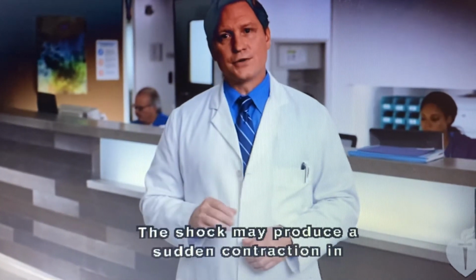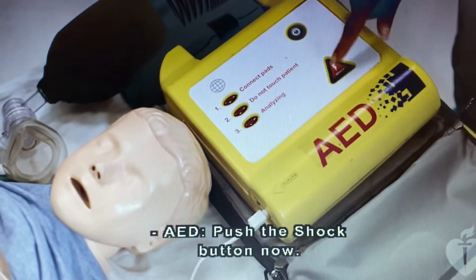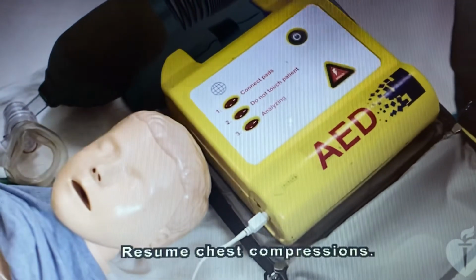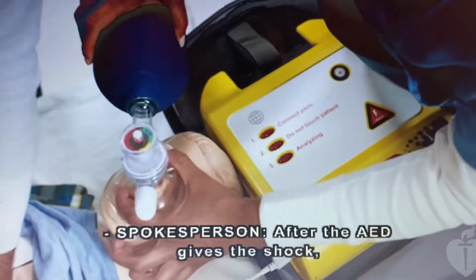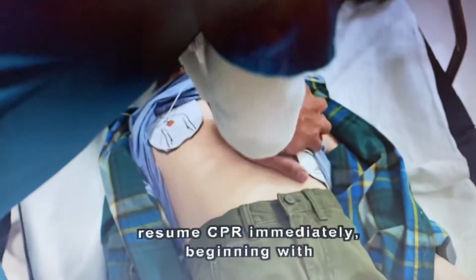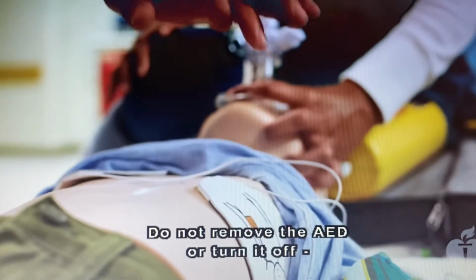The shock may produce a sudden contraction in the victim's muscles. Push the shock button now. Shock delivered. Resume chest compressions. 1, 2, 3, 4, 5. After the AED gives the shock, resume CPR immediately, beginning with chest compressions. Do not remove the AED or turn it off.